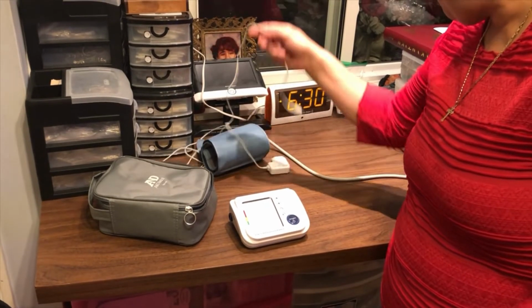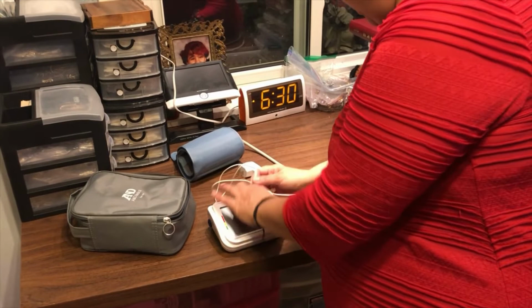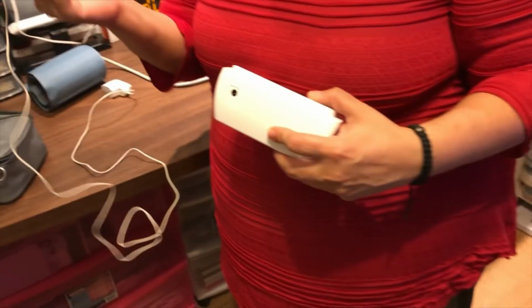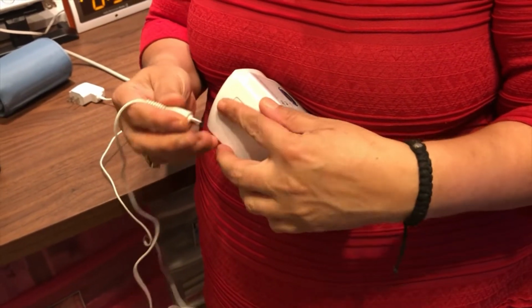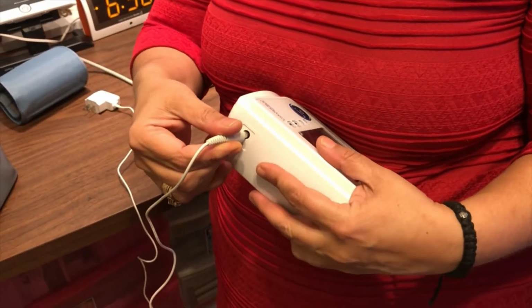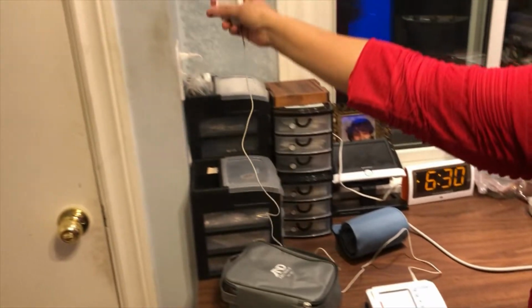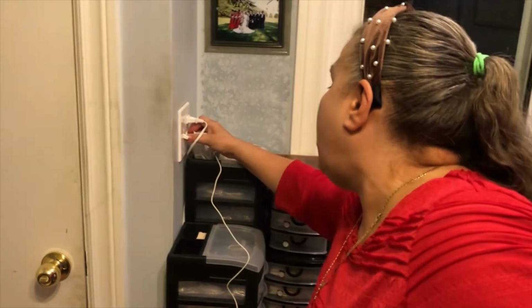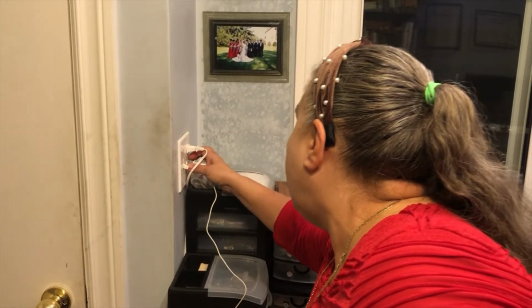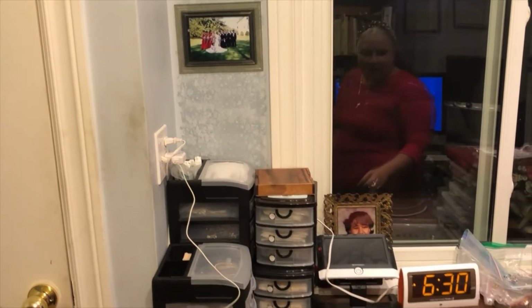So the one at the back is your power source. You take the tip of the power source that feels like a little knob, and you insert it into the hole at the back and plug it into the wall. Now again, you don't have to if this is charged, but I'm just going to show you guys. So, okay, it doesn't work that way. All right, I've plugged it in.